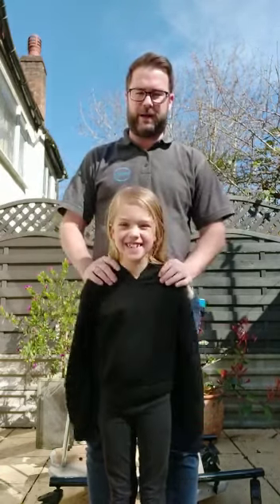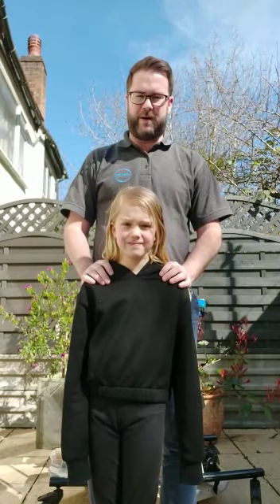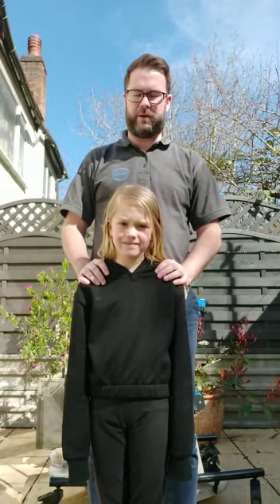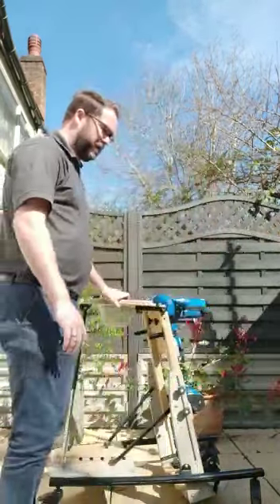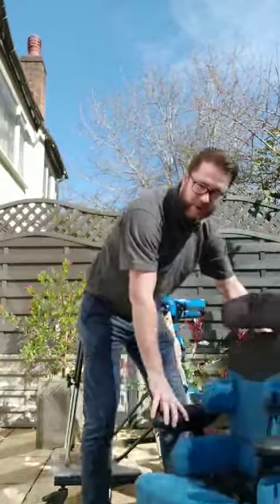But yeah, bear with us. We're trying to advise you on how to get your child from a seated position into our prone standing frame. Right, let's go. So Bella's going to get into one of our chairs.